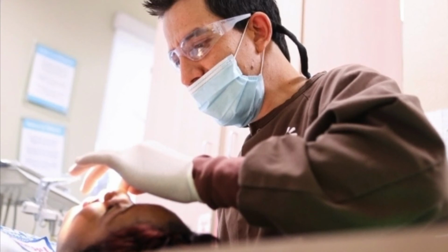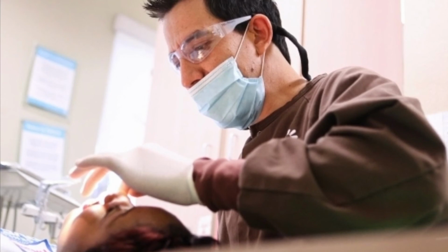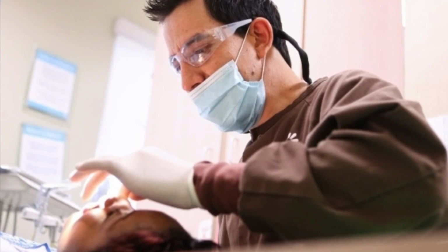The K-type files or K-type instruments are useful for penetrating and enlarging root canals, and they come from a triangle or a square or trapezoid. These are called the K-type instruments and reamers.